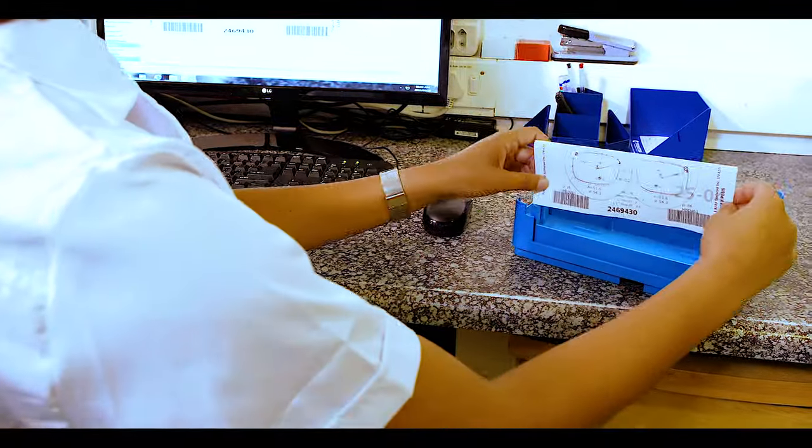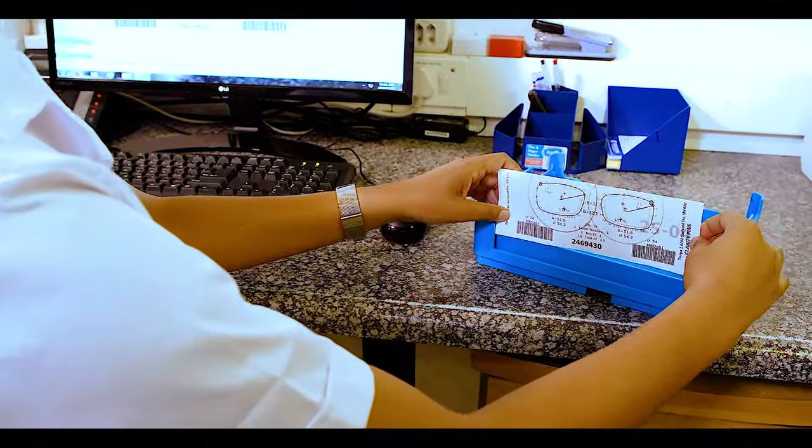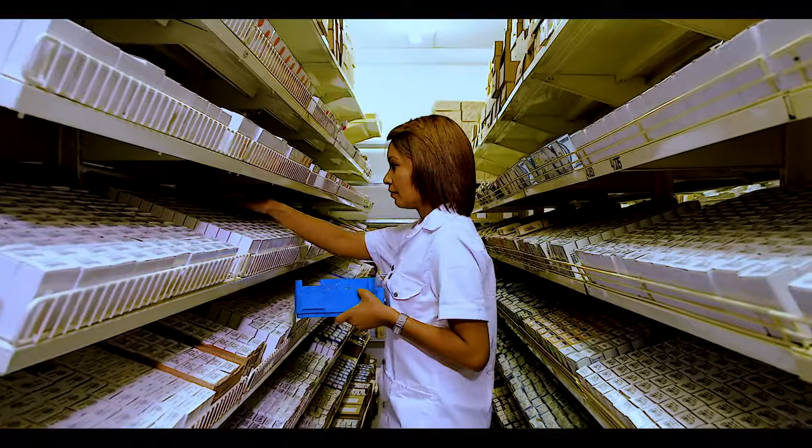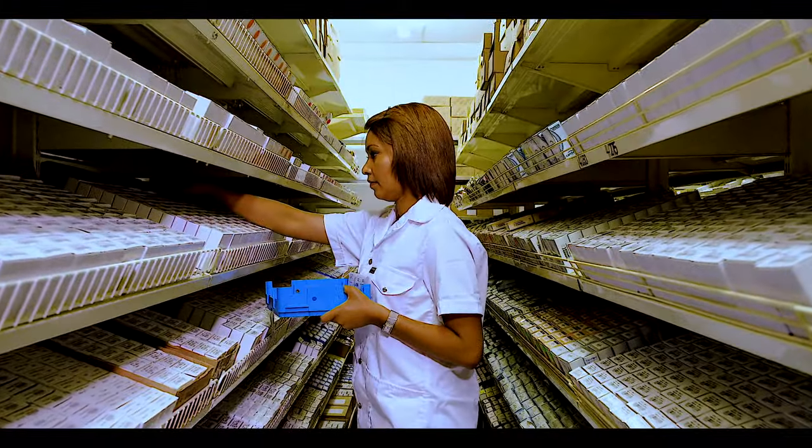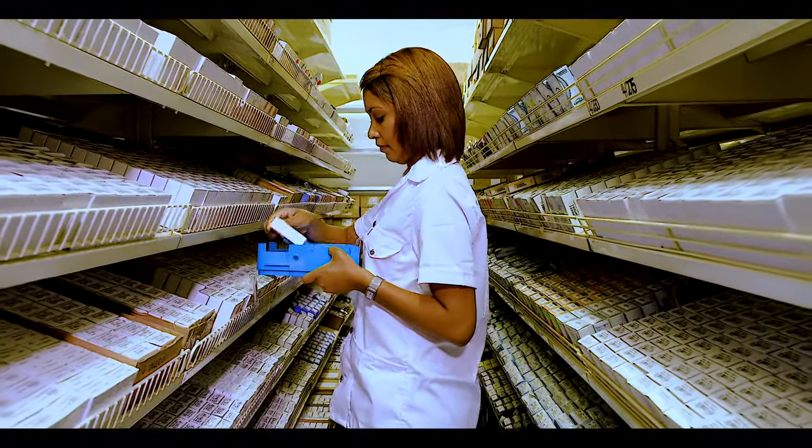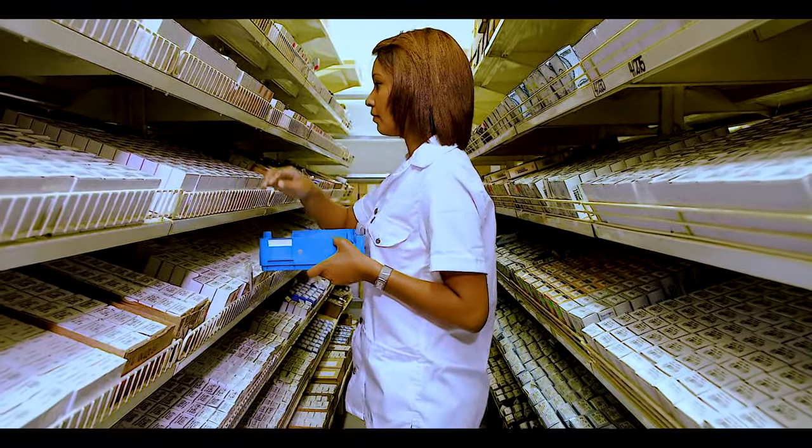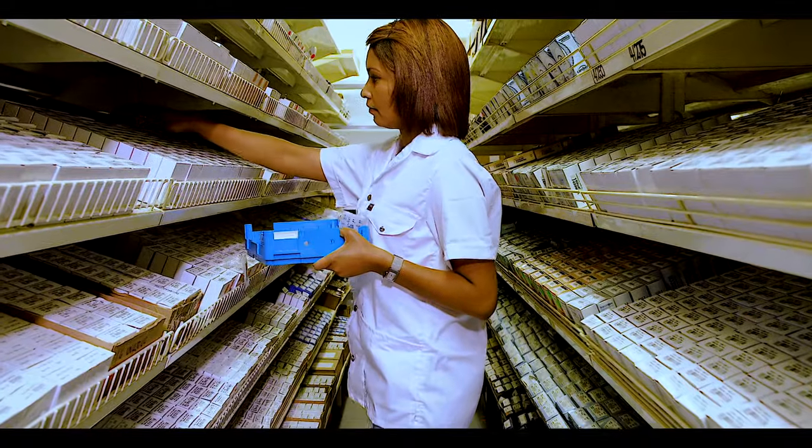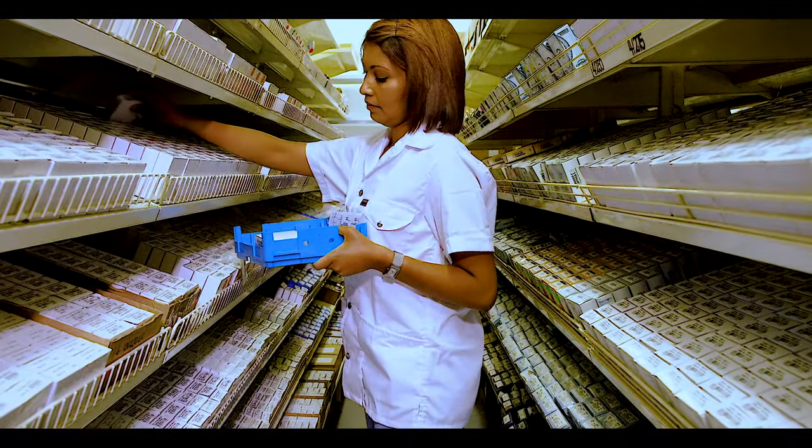After the order is in the laboratory computer system, the technician begins by selecting the ordered lens material to optimally manufacture your prescription.